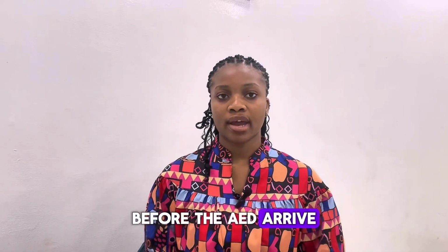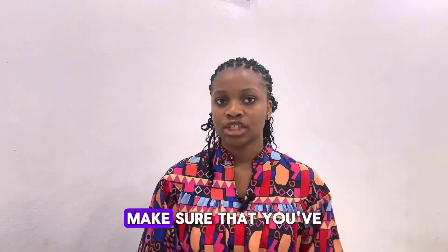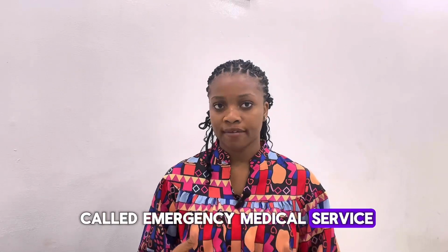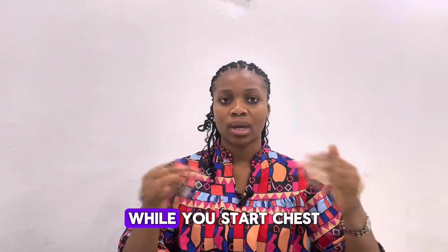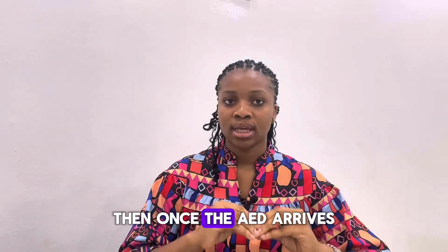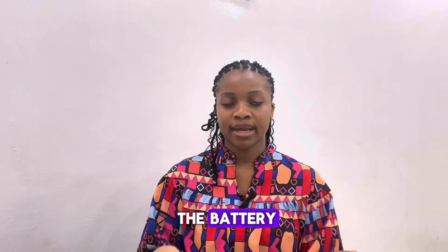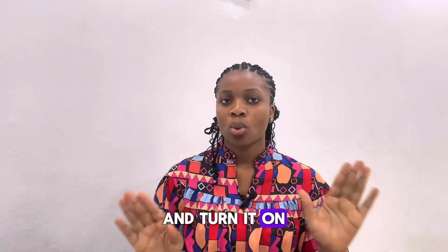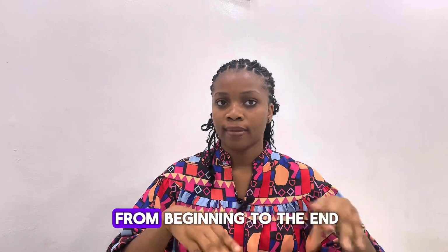Before this AED arrives, make sure that the scene is safe for both you and the person you are trying to save. Make sure that you've called emergency medical service number 112. Then instruct someone to get the AED while you start chest compression immediately. Then once the AED arrives, the first thing you do is just insert the battery and turn it on. Once you turn it on, listen to the prompts. It guides you throughout from beginning to the end.